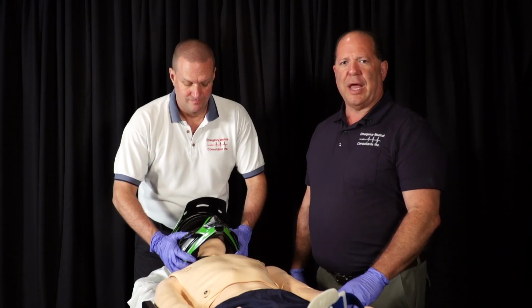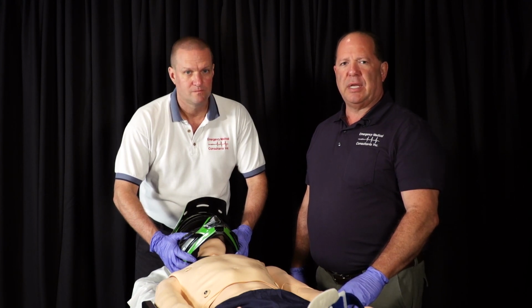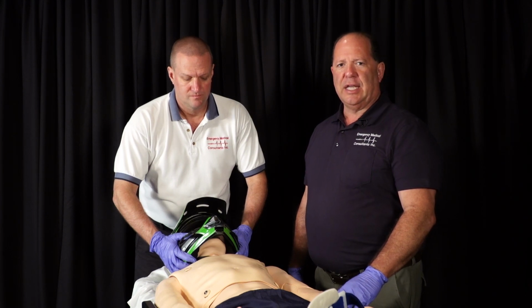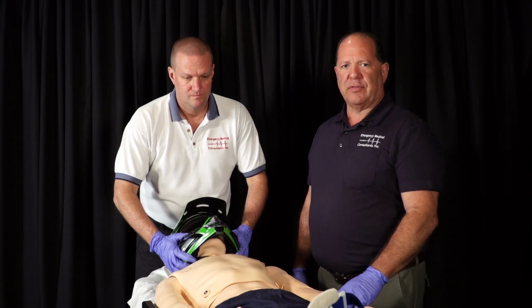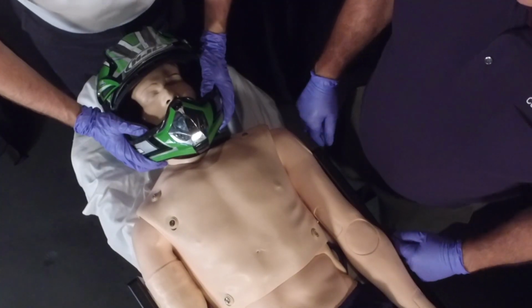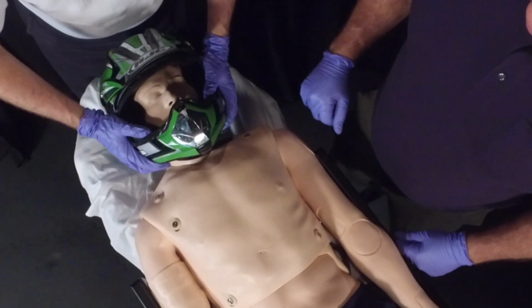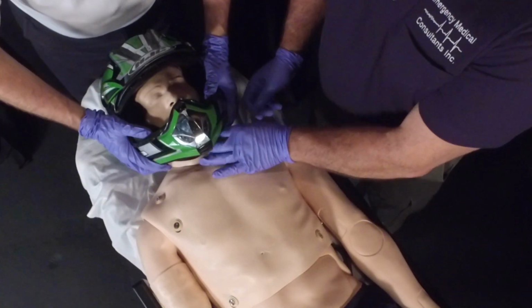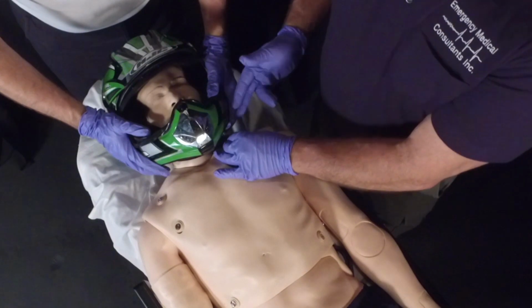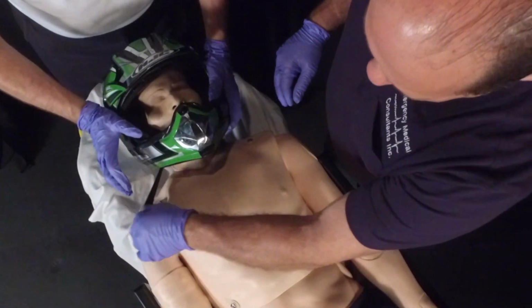In this section, we'll look at removing the helmet briefly. The speed at which this needs to be done really is based on the stability of your patients, that is, his airway and his level of consciousness. So the first person should be evaluating that as well as holding the C-spine neutral by holding onto the helmet. The second rescuer would remove the helmet strap. If this was urgent or critical, I may choose to rapidly cut the strap.